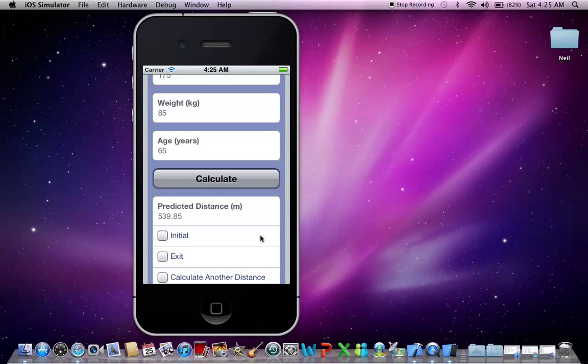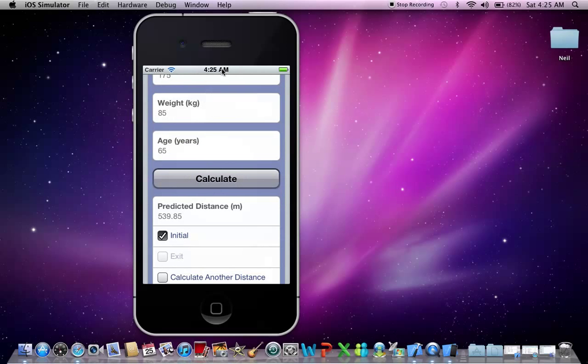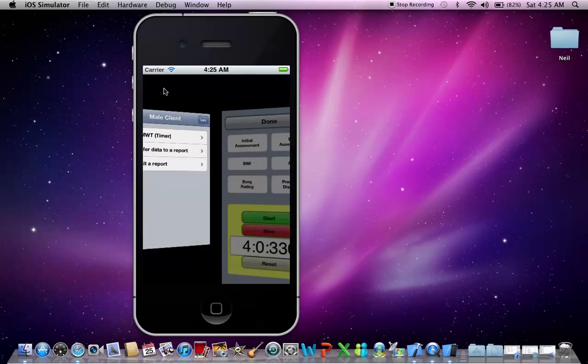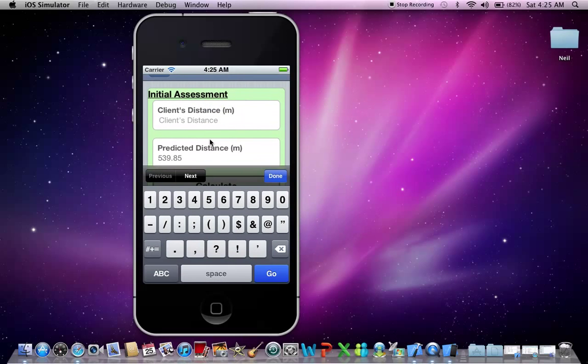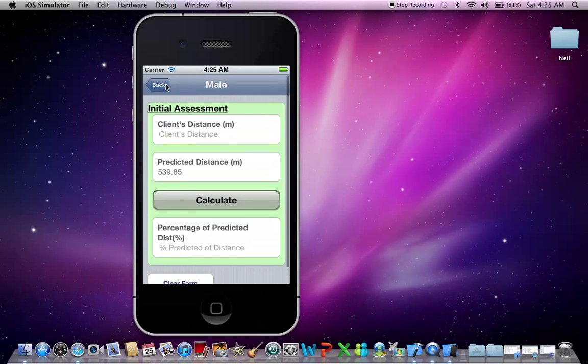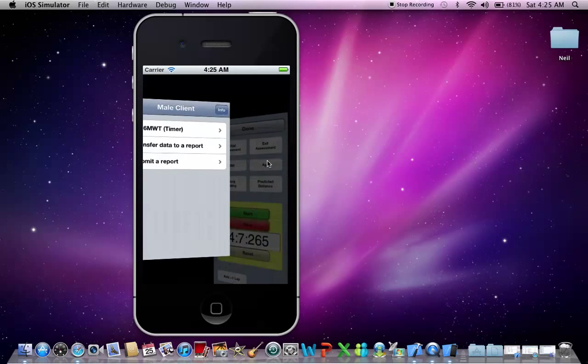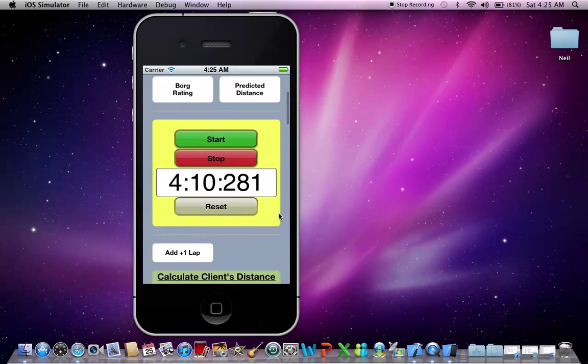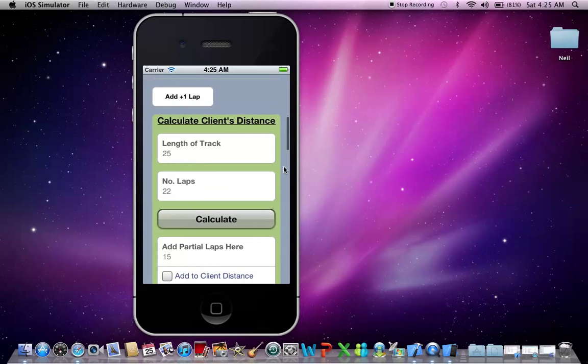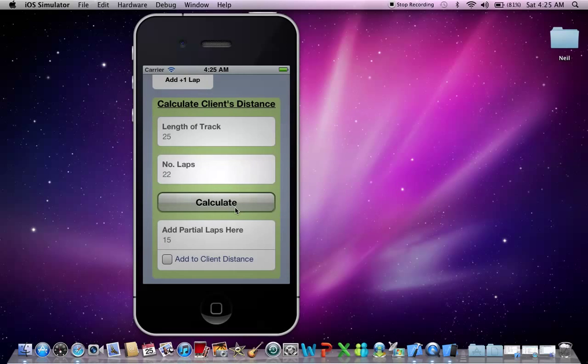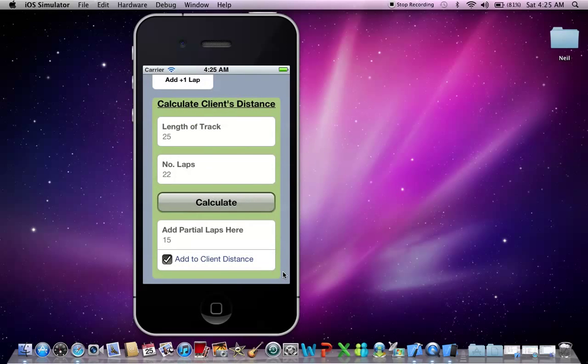So now that we have the predicted distance, let's add that to the initial assessment. Okay, let's see that over there. And there it is. But we still need a client distance. You can either put that in yourself, or you can use the client distance calculator, which is here. So let's say a client has done 22 laps and 15 meters on a 25 meter track. Let's calculate that, and add those partial laps on as well.